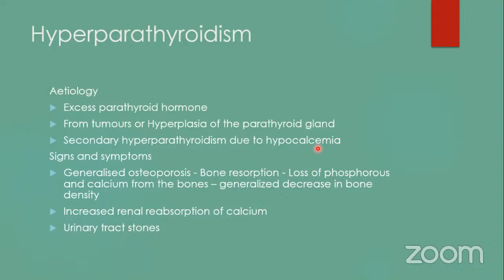It's possible that patients will have urinary tract stones, and if a clinician is not careful, they may just treat those stones but not query where these stones are coming from. And probably if the same patient had an X-ray of the jaws done, one would notice that there is an issue with the bone.